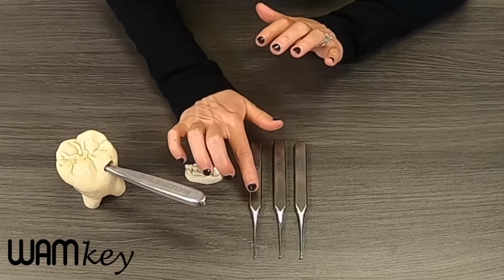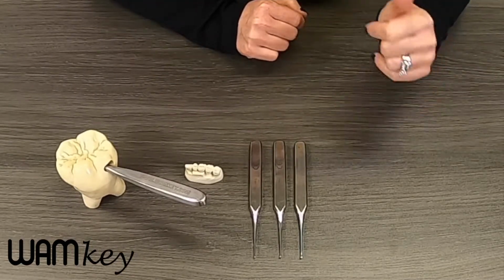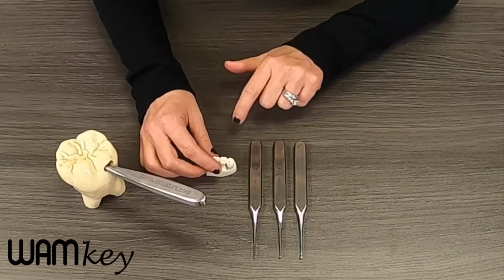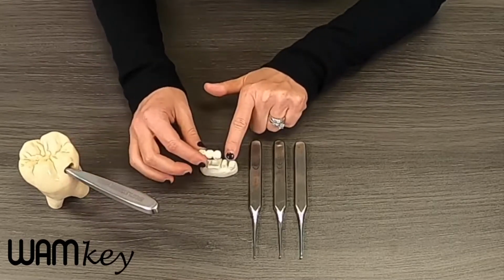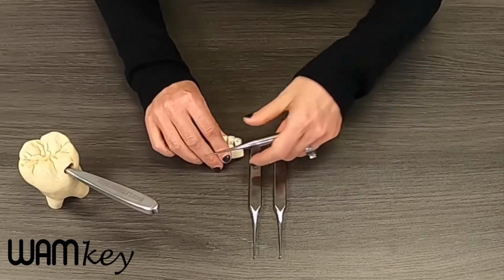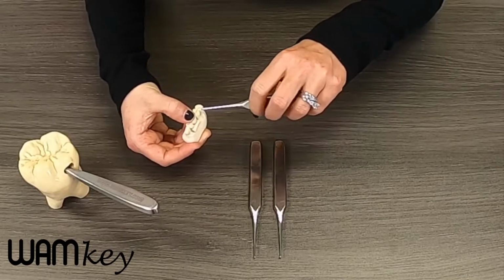So we would usually recommend to start with the number 1 WAMkey, and then if you need to move up in size because you've either drilled the hole a little bit too large, or there could be a little bit of decay or an amalgam core underneath this area, that would cause the key to just spin inside the hole and get no torque to push the crown or the bridge off. It would just spin.